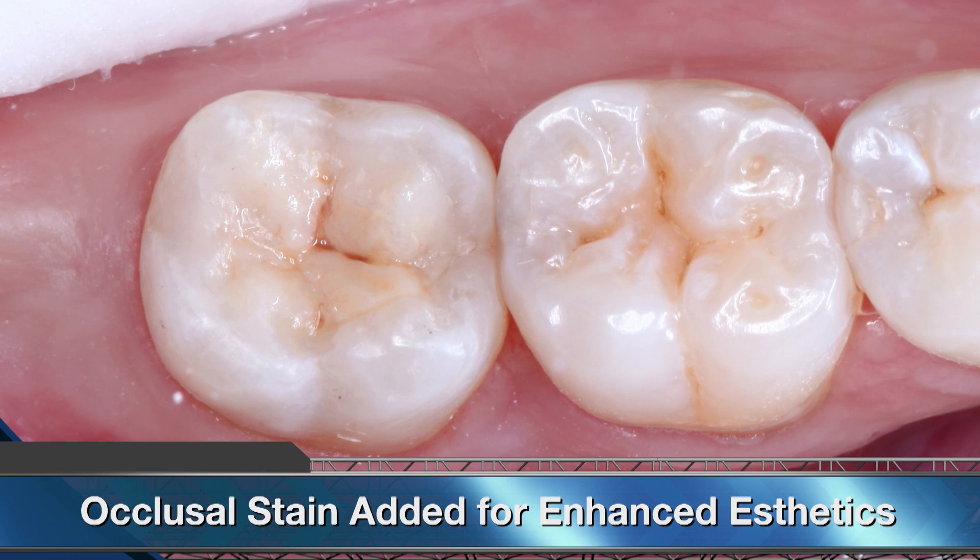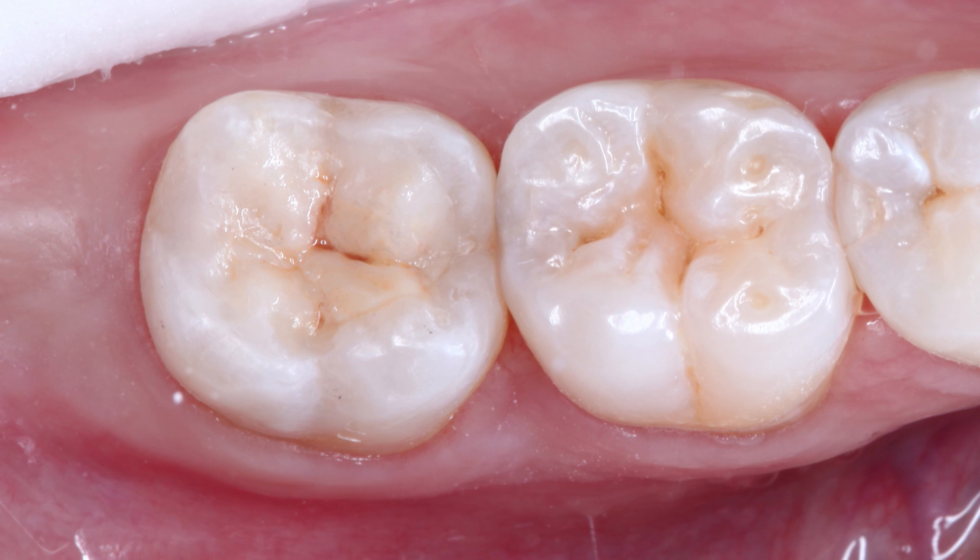We were able to successfully restore the patient with a direct camouflage resin restoration that's both strong and provides great natural aesthetics. Two days after the procedure, the patient reached out and told me all of the pain and sensitivity has stopped. As a clinician, it's gratifying to be able to take our patients out of pain and address their issues in the least invasive way possible. Thanks for tuning in for this episode. We'll see you on the next one.